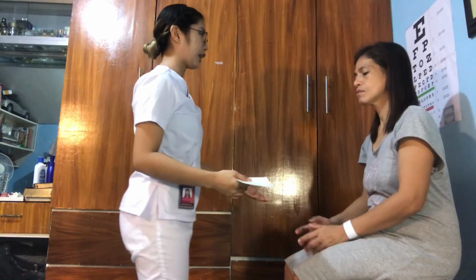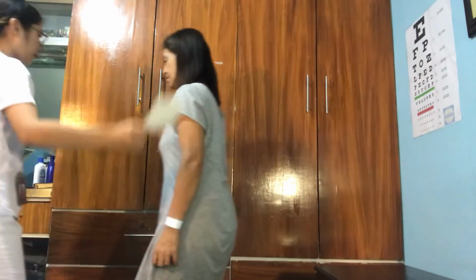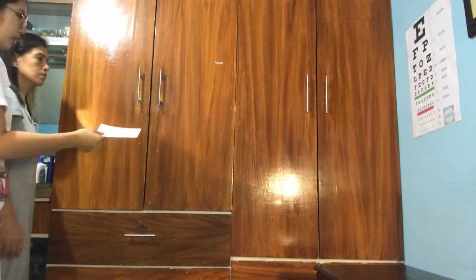So we are going to use a small card to cover the left eye or the right eye of the patient as we assess only the right eye and left eye. So Mrs. Tria, tayo po muna tayo, okay? Dito po tayo, okay, harap po tayo doon. Magbabasa lang po ulit tayo.